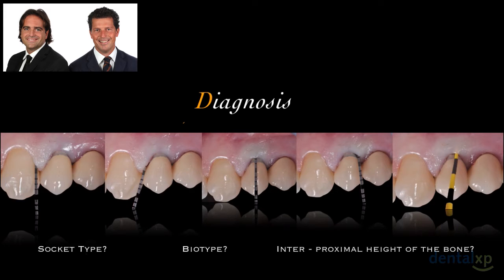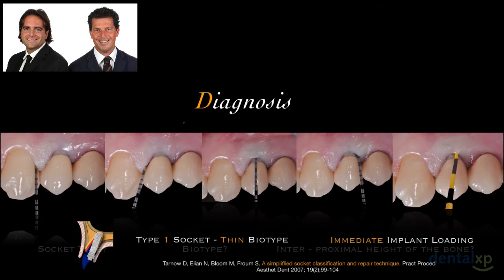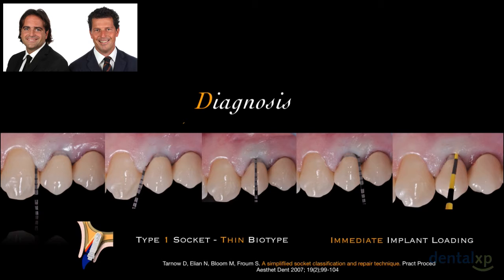We want to know which kind of socket type we are in, which kind of biotype we have in the front, and if we had interproximal loss of bone height. To do this, we do the bone sounding, with a little bit of anesthesia of the patient, and we found that we were in front of a type 1 socket with thin biotype, and our decision was to go for immediate implant placement and loading.